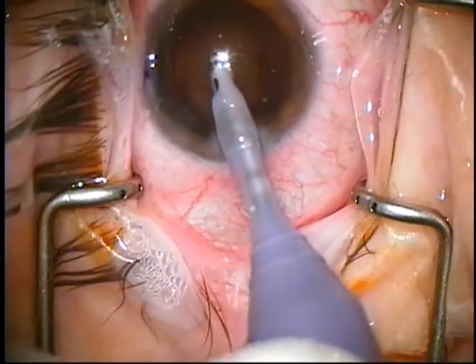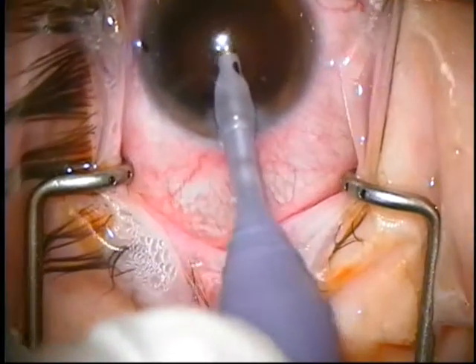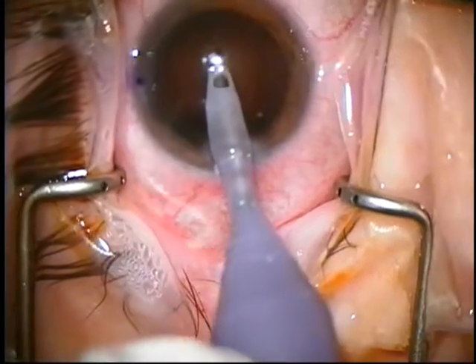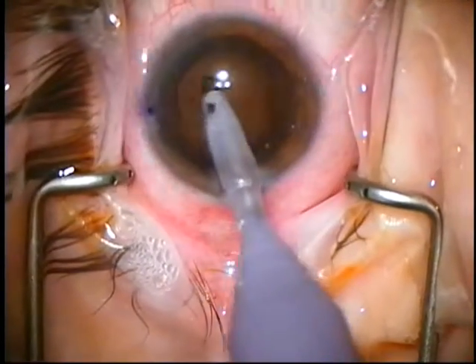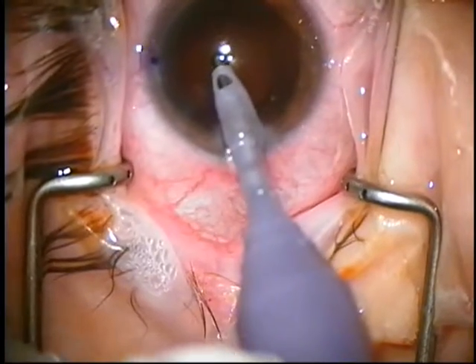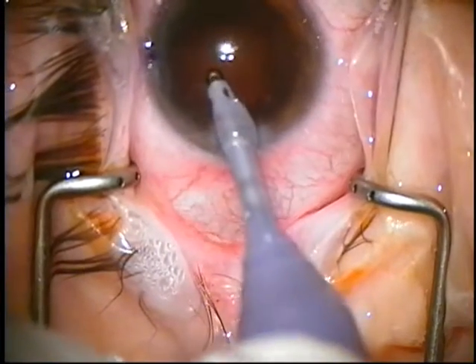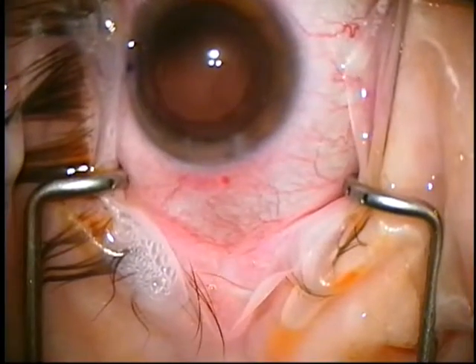Polish, please. If you see down here, there are some residual. Just turn face down. It's under five. Great. Stop, please.